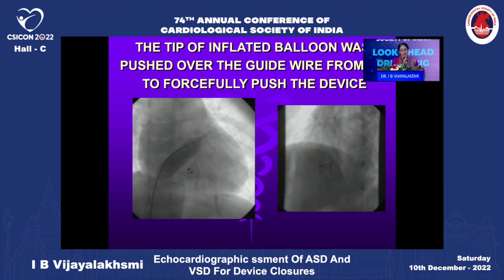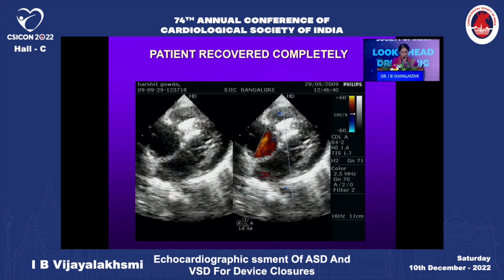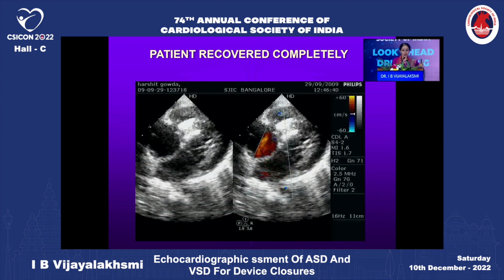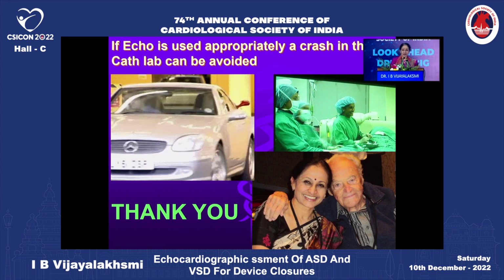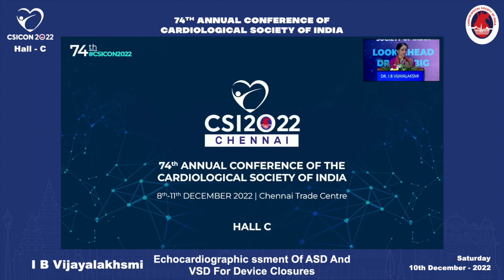And thanks to echocardiography, because the OR was not ready, if I had not done this, I would have lost the patient on the table. So till now, I have never lost one, thanks to echocardiography, which is always handy. So friends, use echo appropriately. Whatever the attractive device closure, it will not end up in a crash and nightmare, thanks to echocardiography, peri-procedure as well as post-procedure. Thank you very much for your kind and patient hearing. Thank you.